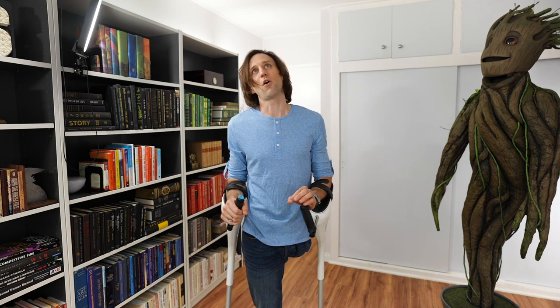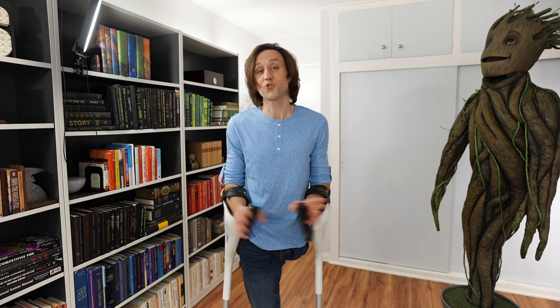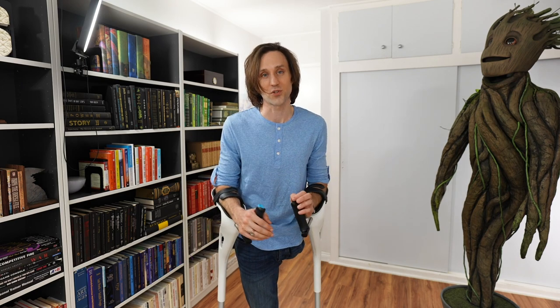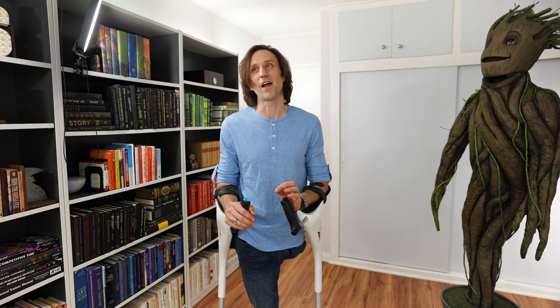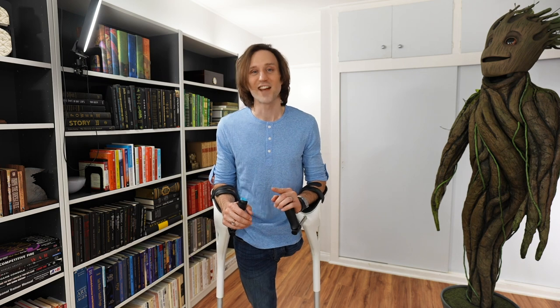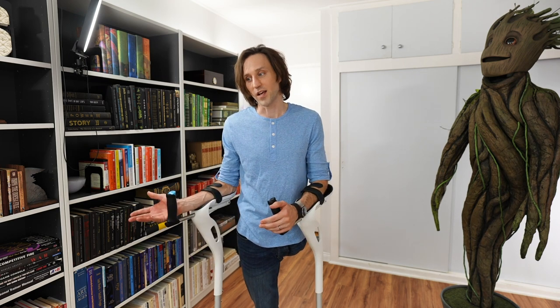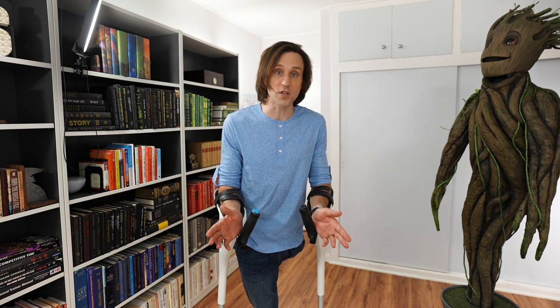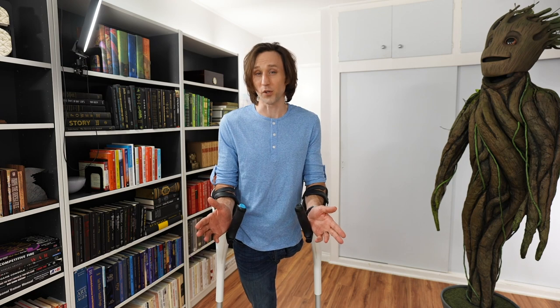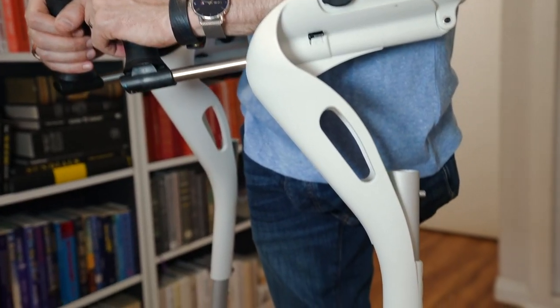These crutches, in my opinion, are perfect for someone who is recovering from surgery and looking for a short-term crutch solution. The reason I say that is because they're one of the only companies making innovative, premium crutches that allow you to rent the crutches short-term instead of just buying them. Because if you just hurt your ankle and you're on crutches for six weeks, you don't want to spend hundreds of dollars on a pair you're only going to use for a couple weeks. The solution could be renting a pair of the MD Crutches.